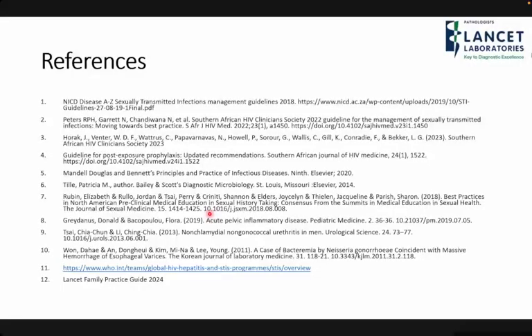And then with regards to sampling, yes, unfortunately we need two different samples. Your gel swab is the one that we normally use for culture, because it preserves the organism and we want those organisms to grow. So that's the one that we use for culture, the gel swabs.